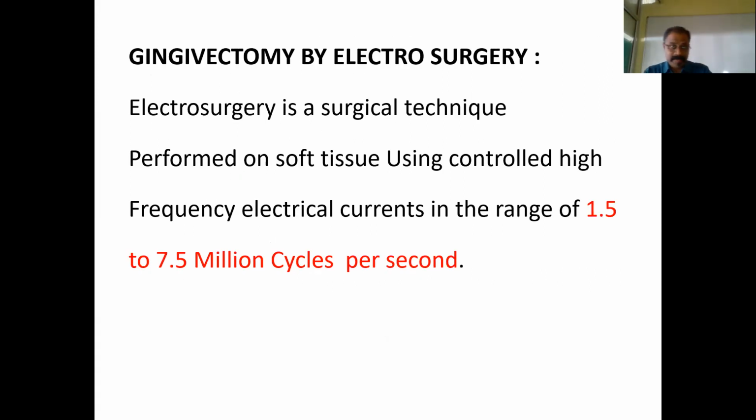So what I discussed so far is your surgical method. You can also do gingivectomy using something called electrosurgery. Electrosurgery is a surgical technique performed on soft tissue using controlled high frequency electric currents, in the range of 1.5 to 7.5 million cycles per second.